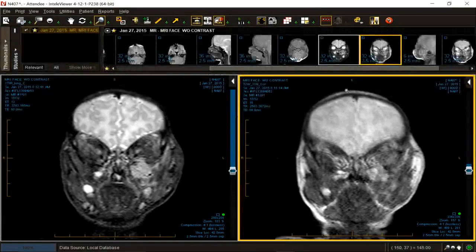I got this case bumped in the middle of the night, an emergency case from Children's Hospital of Puerto Rico. They said, a girl came in the ER and she has a mass on her face. How long has she had it? I asked at 12 o'clock in the morning. They said, oh, it just came up. We just noticed it. Okay. Well, that should be something like a hemorrhage or a bleeding rhabdomyosarcoma or an aneurysm or a pseudoaneurysm or an infection or a cellulitis. The answer was none of the above, and the history was a fib. They were just scared.